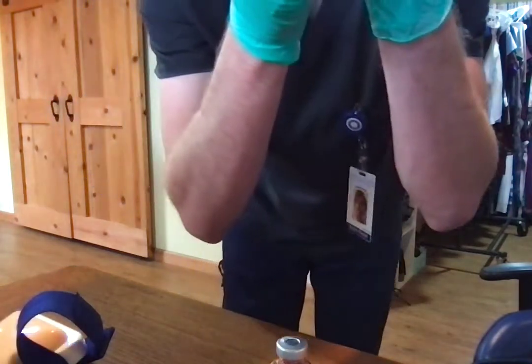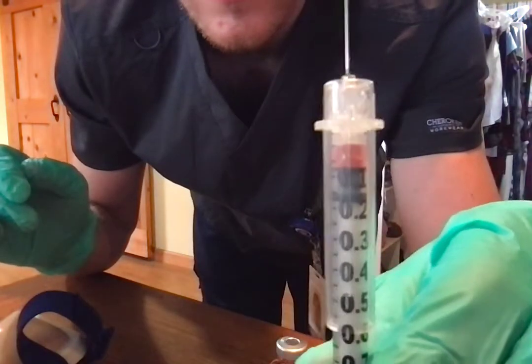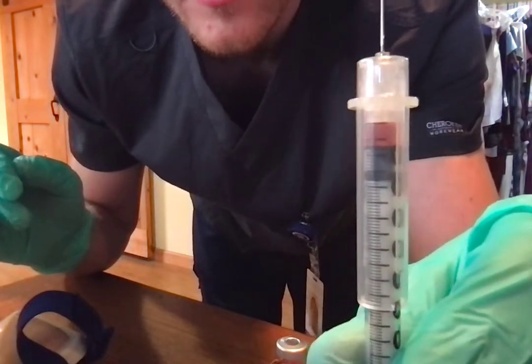And I'm making sure if I have any air bubbles, flicking it for that. And let you guys see where we're at there. Hopefully you can see that.